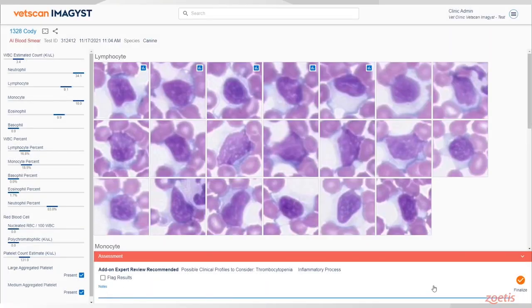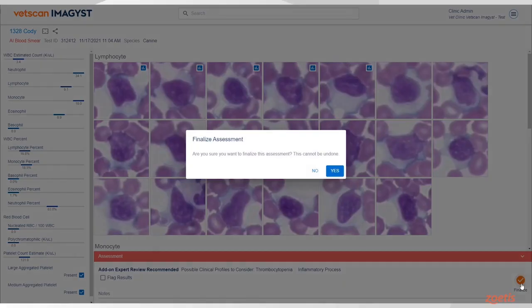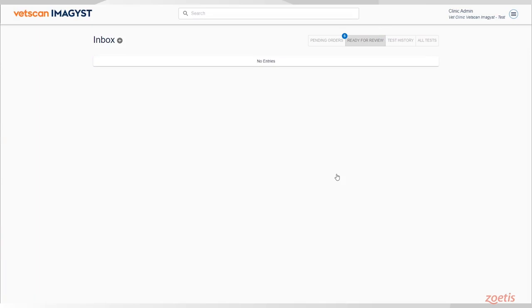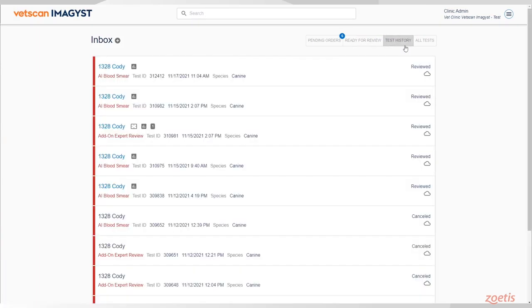Now finalize the report. This indicates that you have seen the report. The report will now move from the Ready to Review tab to the Test History tab.